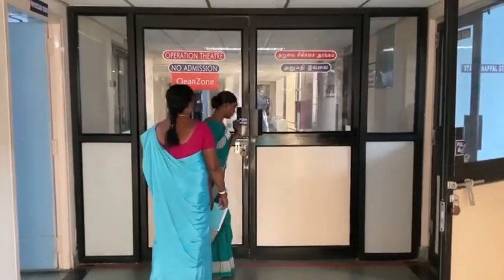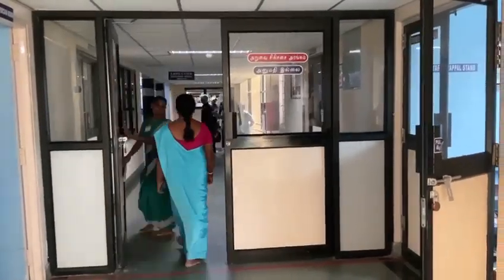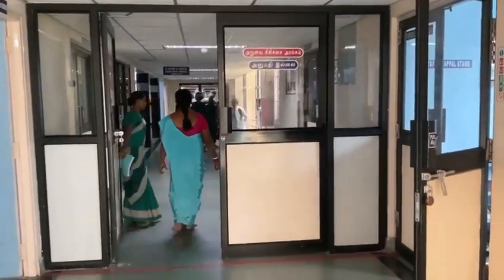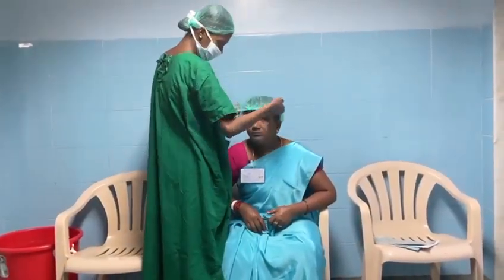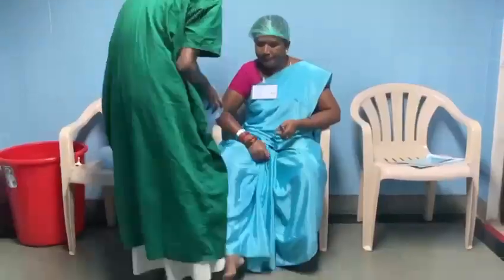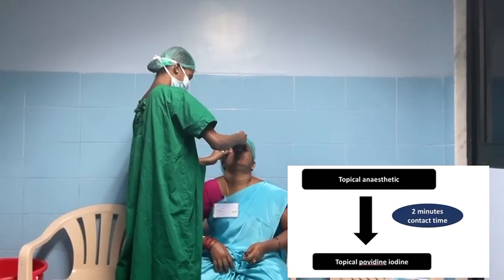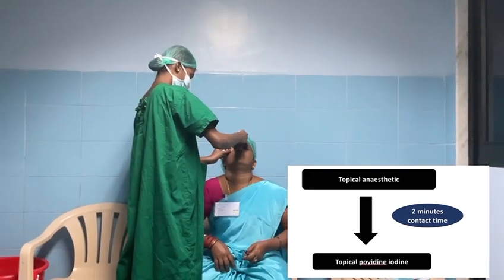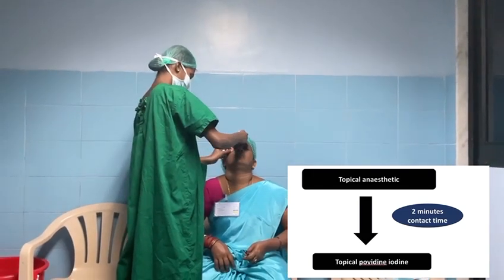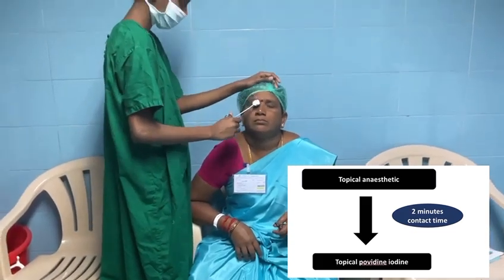Then the patient is escorted to the operation theater. Head cap and shoe cover is worn. After instilling topical anesthetic and topical povidone iodine with a contact time of 2 minutes, the eye is cleaned with povidone iodine externally.